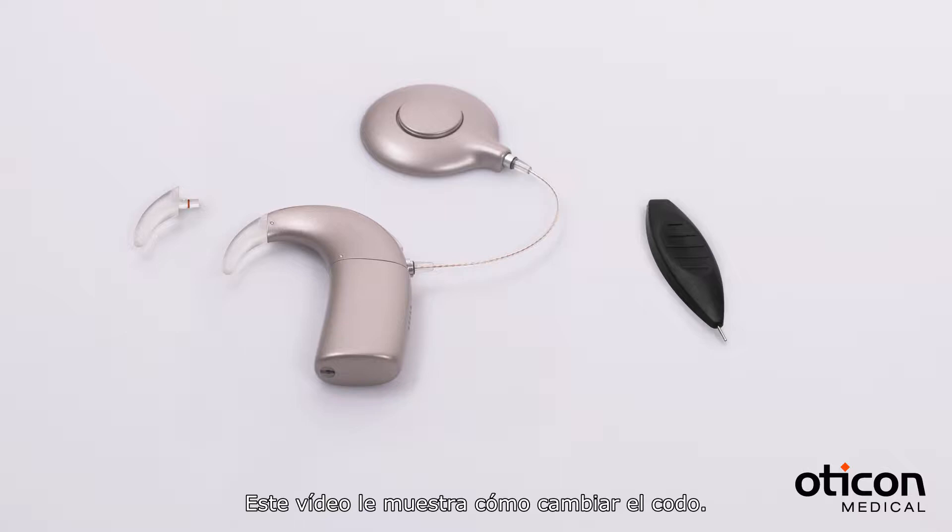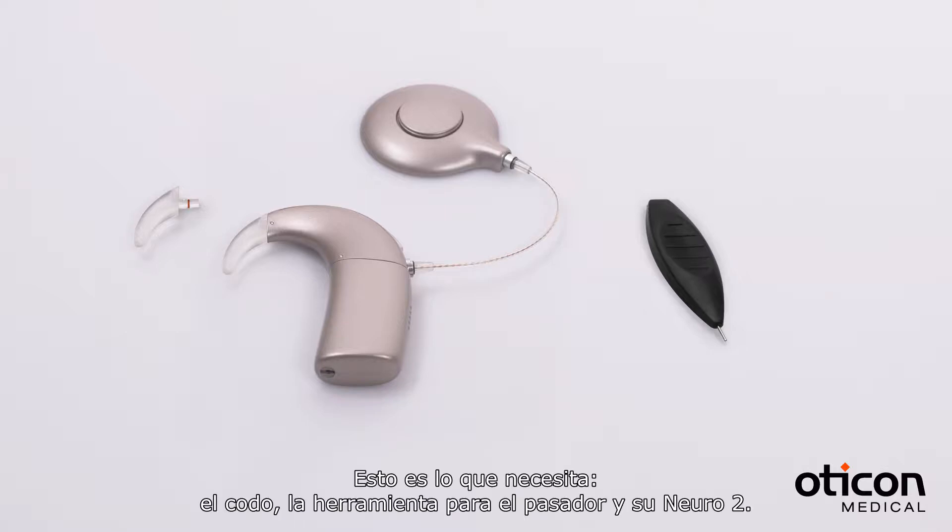This video shows you how to change the hook. Here's what you need: a hook, the pin tool, and your Neuro 2.